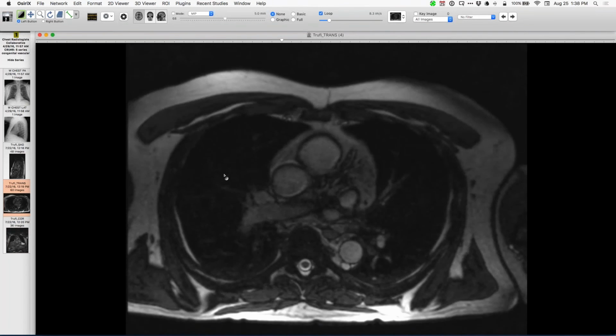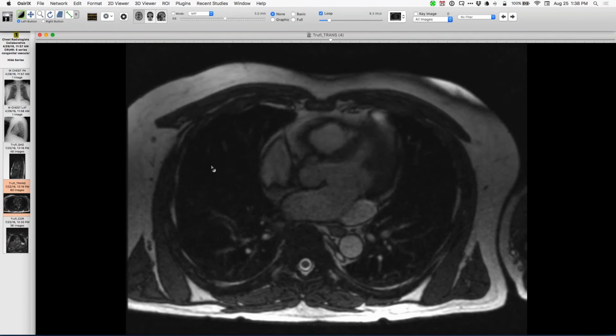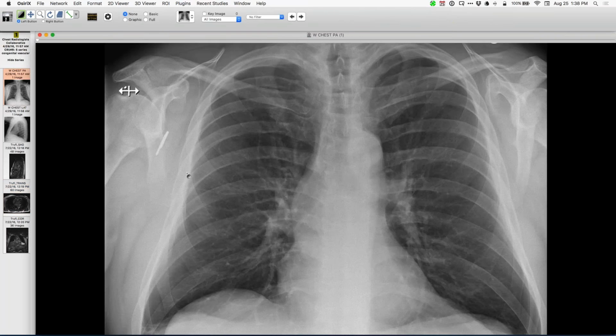Okay, Jeff, those are my cases. Can you see the left SVC on the radiograph in retrospect? Gosh, I could not. No, can't see any hint of it. It's just plastered over there. Okay. Cool. Travis? Now we kind of know why this looks the way it does, sort of, because that SVC is not there. Travis or David?